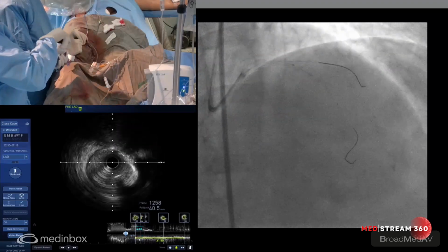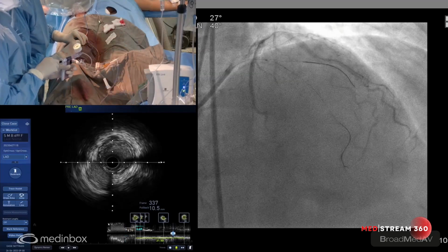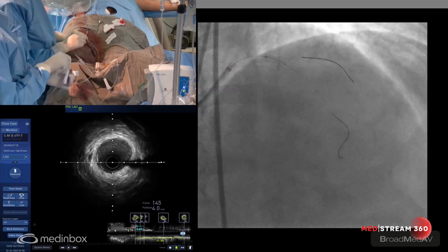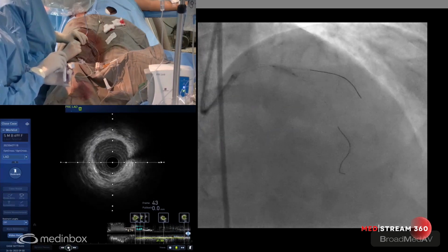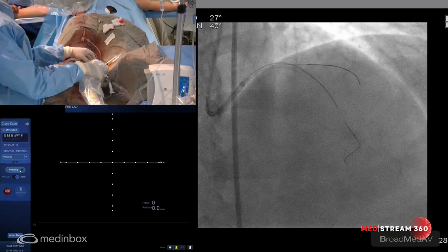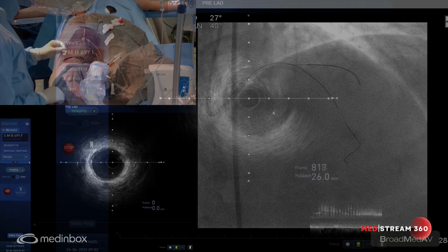Go up again, please. Okay, so we're going to go up a little higher pressure there. Yes, please. 6, 8, 10. Okay, all right. So let me go live. Take care.